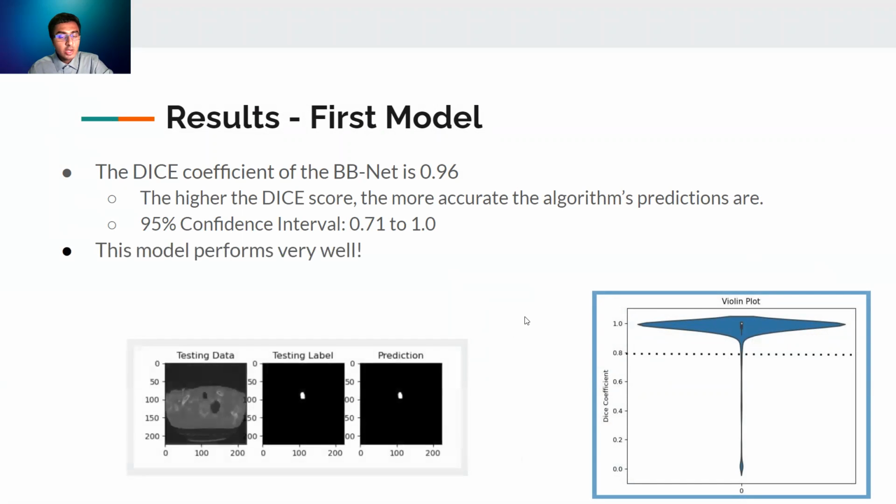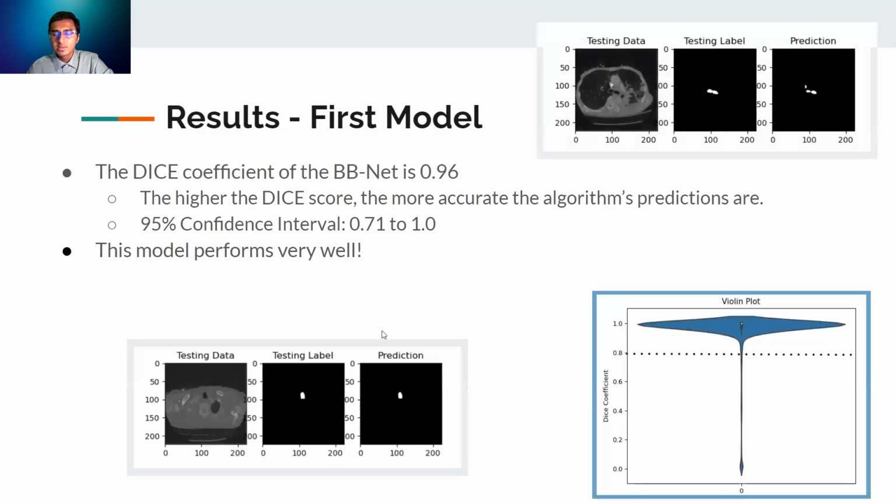We can see a correct prediction of a trachea. The location and boundaries of the trachea are predicted correctly. We can see a slightly less precise prediction of a trachea. The boundaries are predicted incorrectly, but because we are only using this model to return the coordinates of the trachea, the incorrect boundaries do not matter, only the location does, and the predicted location is correct.